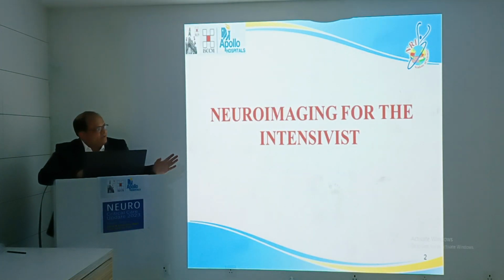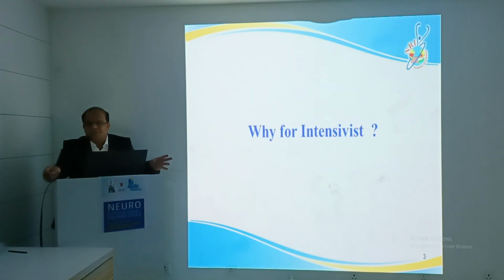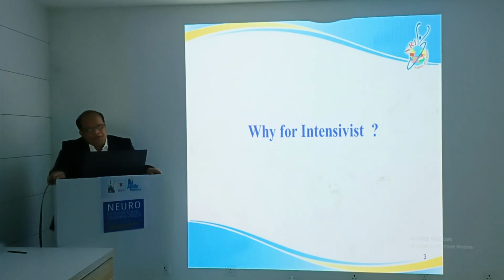In the next 18 to 20 minutes, we'll have an interactive session on a very important topic: neuroimaging for the intensivist. One, what is the need of this for the intensivist? Because anyhow we are having the radiologist. Yes, but you're the person who is continuously taking care of the critically ill patient.